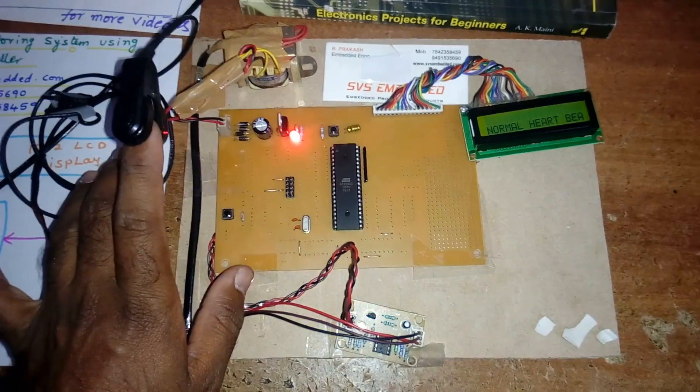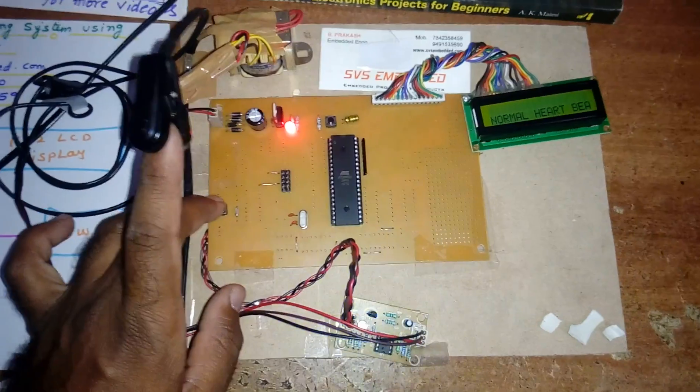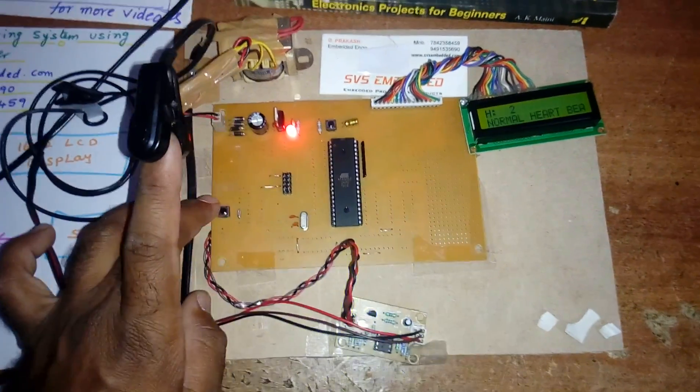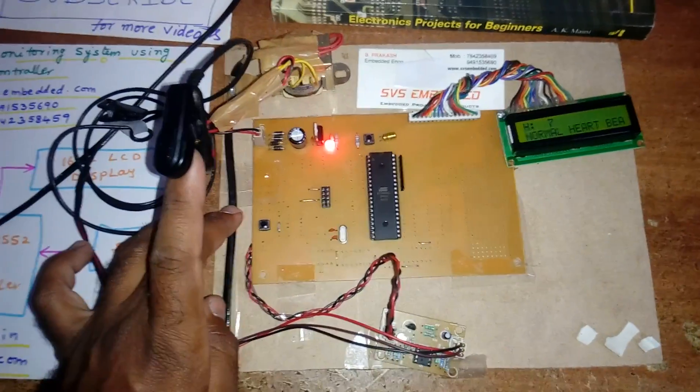100 and above is high heartbeat; 60 and below is low heartbeat. If you want to take the heartbeat, press the button and it will count the pulses. You can count any number of times like that.